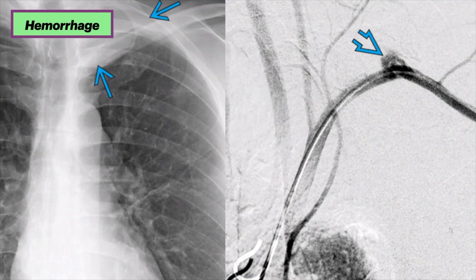The next case is hemorrhage. The PA chest x-ray shows a unilateral opacity at the left lung apex, consistent with an apical cap. In an acute symptomatic presentation, an apical cap is suspicious for hemorrhage extending along the superior sulcus of the lung. The DSA digital subtraction angiography image shows a left subclavian artery pseudoaneurysm due to vasculopathy. Apical caps in the setting of trauma or line placement should be further evaluated.